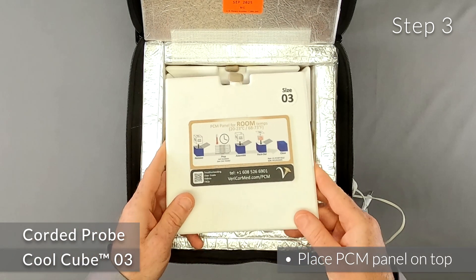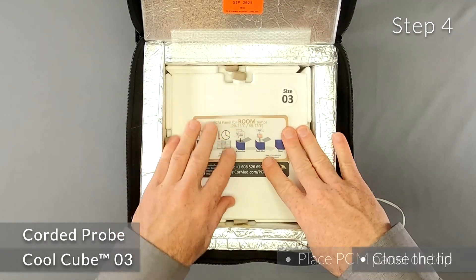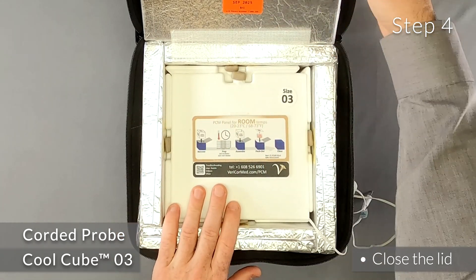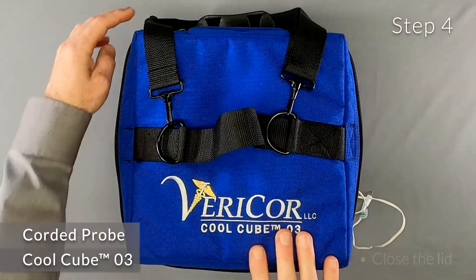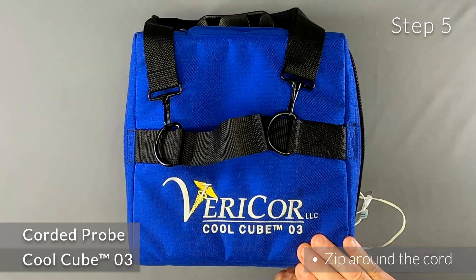Step 3: Place the last PCM panel on top to complete the chamber. Step 4: Close the lid of the CoolCube. Step 5: Zip the two zippers around the corner where it comes out.